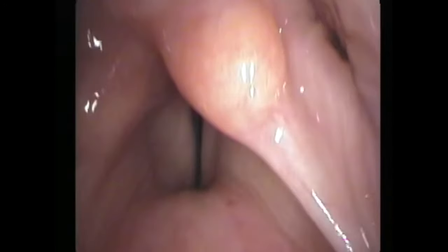And when I did, here's what her vocal cords looked like two weeks later. She could breathe again normally. Her left lateral cricoarytenoid muscle now positions the left vocal process somewhere near the midline. It's enough tension to give her a voice, and yet she has a much larger airway to breathe through.